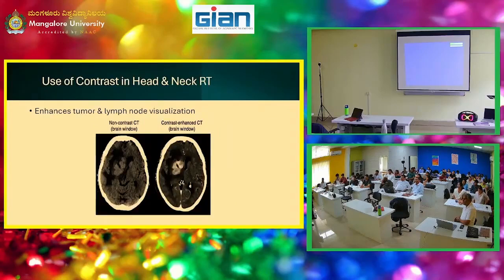Here, for those of you who don't know, in CT, you can have CT with what's called non-contrast, or you can have a contrast-enhanced CT, and so that's an injection, okay? Contrast agent that's going to increase the contrast in your blood, and so that changes the look depending on the distribution of the contrast agent, okay? And so you do that so that you can better identify the tumor, okay? And so that's a form of image enhancement, right? You're trying to clearly get a good handle on the targeted area.